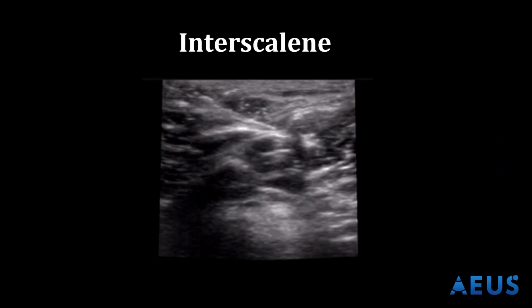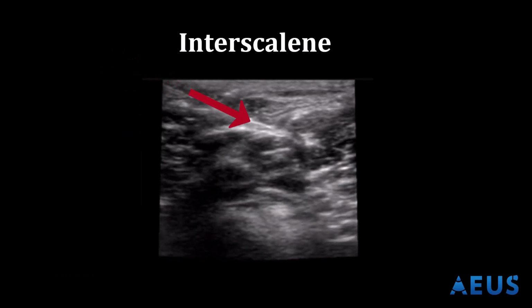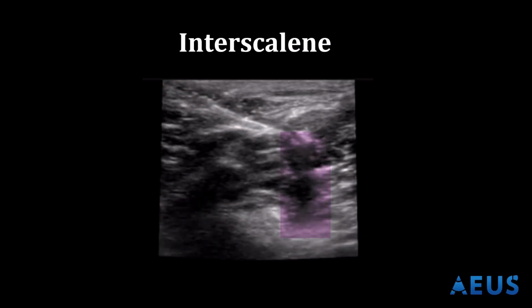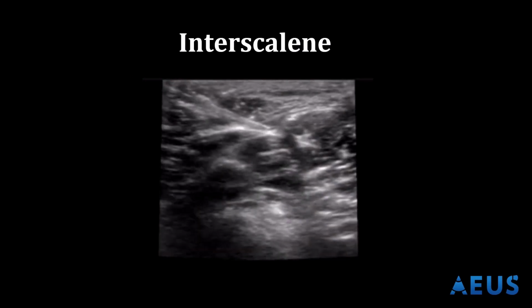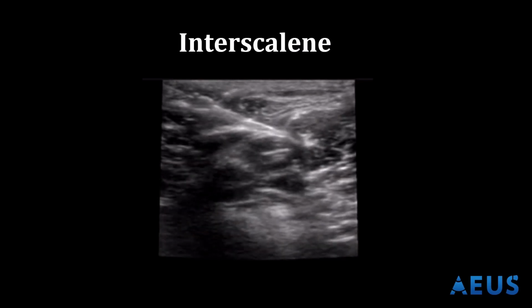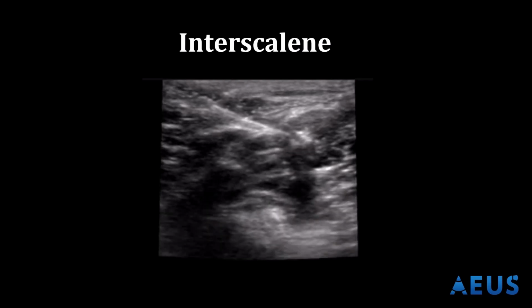This is a video of an interscalene block. So we'll see the needle coming in posteriorly through the middle scalene and approaching to dissect the potential space right there, a beautiful dissection of the space between the scalenes. One more time, we'll watch that. And anesthetic dissecting the potential space.